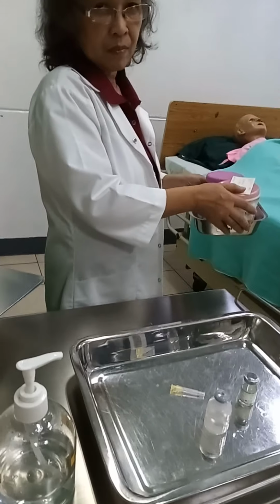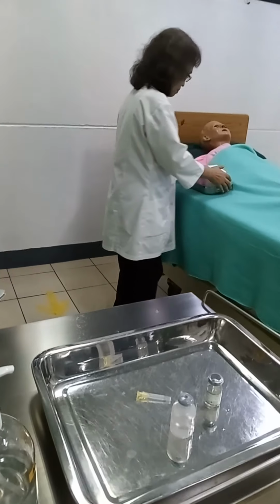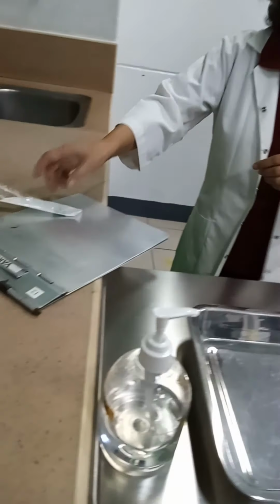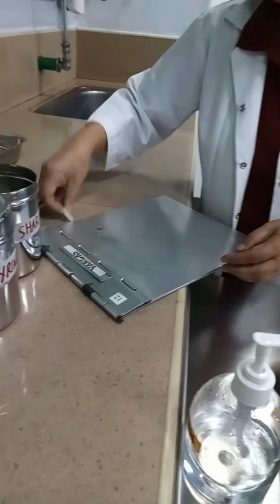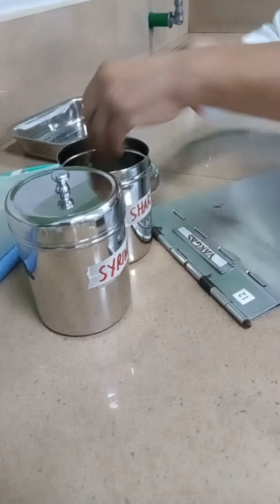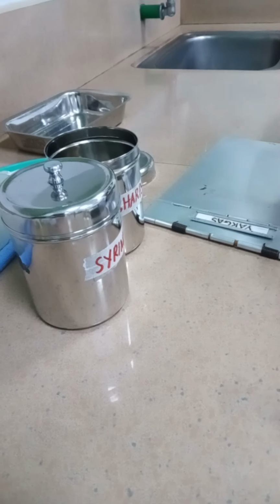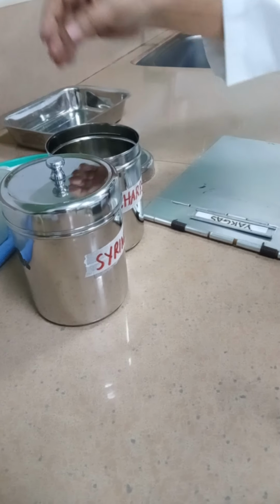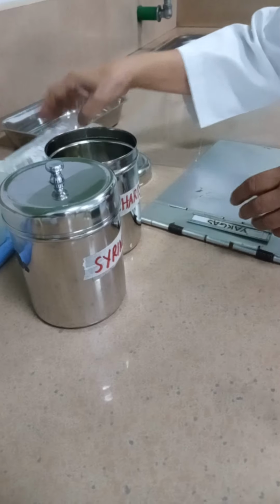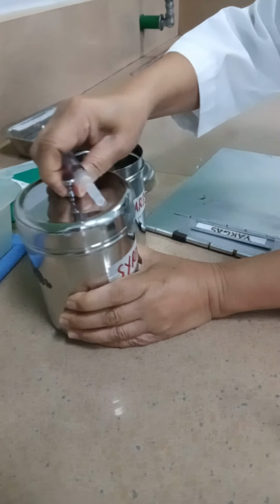Right, so you have to dispose of soiled supplies, broken ampoules, and or used vials in special containers for glass and sharps, and even syringes, and discard this equipment that you have used in the proper container.